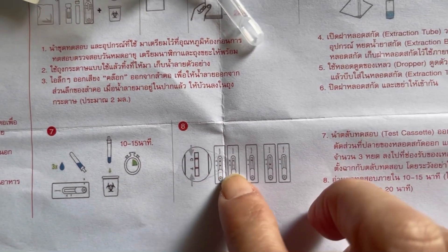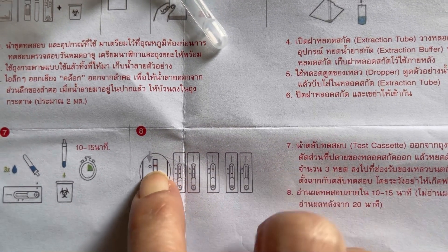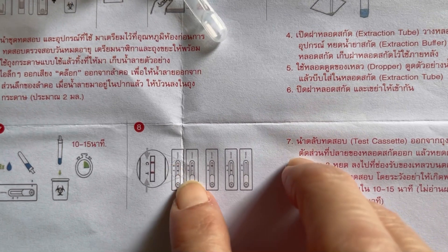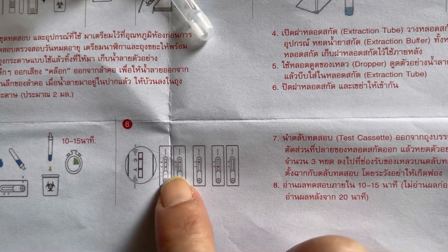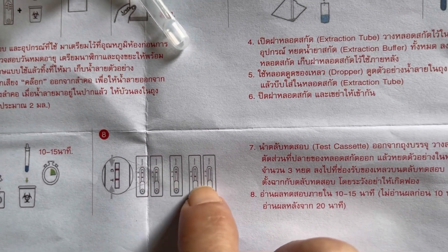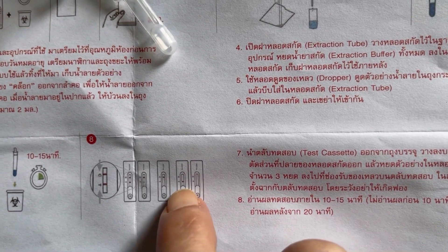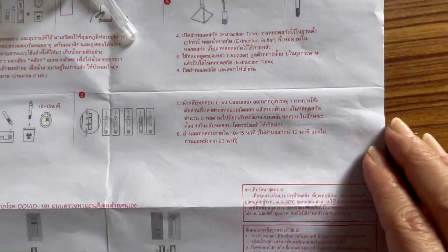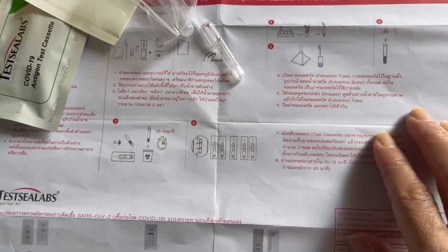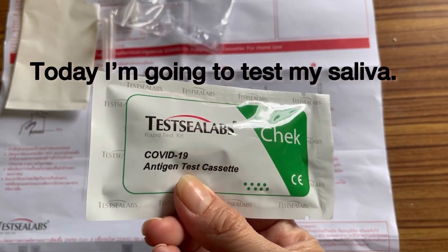After waiting, you will see the result. If you see only one line, it means negative. If you see two lines, it means positive for COVID. If you cannot see anything, or if you only see the line below without the control line, it means invalid.